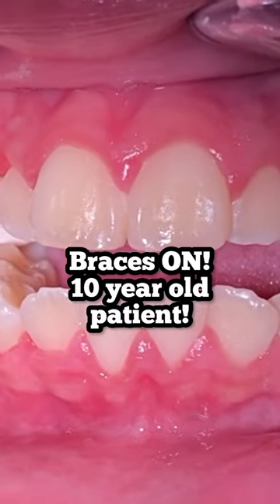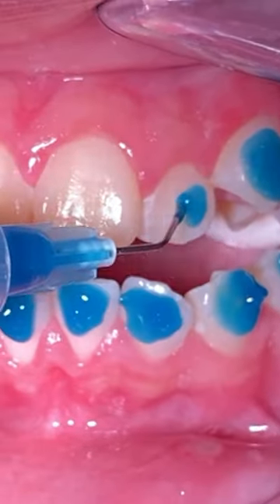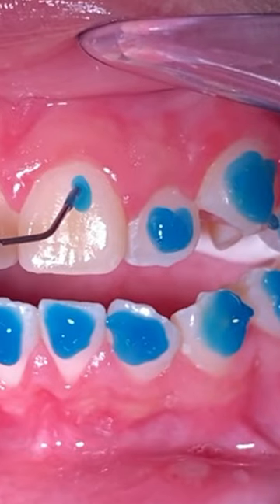Hey everyone, this is Abby your hygienist here at Tooth Time. Here is a quick video of how we put our braces on.